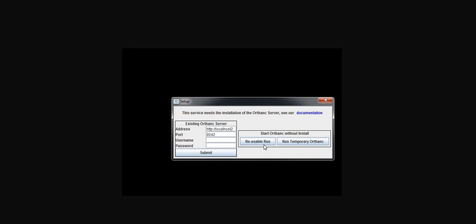So if I don't have a proper Orthanc server, I have the possibility to run locally Orthanc triggered by Orthanc tools. There are two modes, one called reusable run.